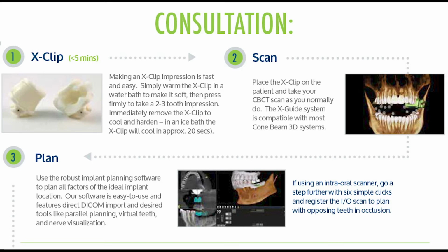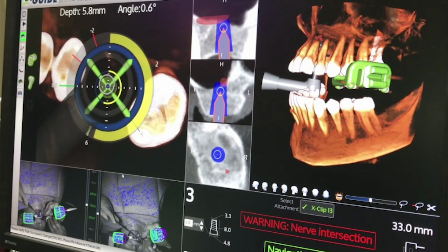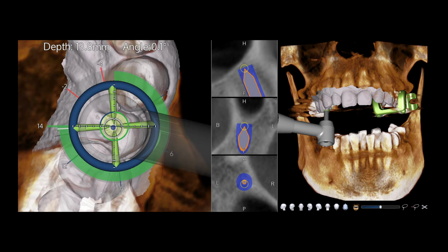The surgery time is shorter, and it is generally carried out as flapless surgery, with a shorter recovery time for the patient. It gives less invasion, blood, and pain for the patient, and immediate loading is possible. Also, bone grafts can be minimized.